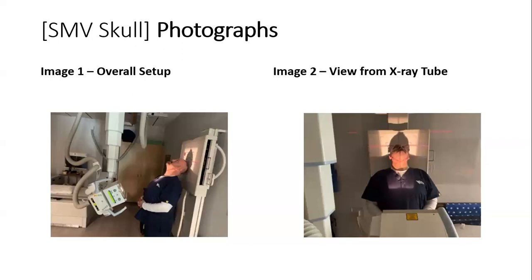Part position: raise the patient's chin and hyperextend the neck if possible until the IOML is parallel to the IR. If supine, rest the patient's head on the vertex, align the MSP perpendicular to the midline of the grid of the table IR. Avoid tilt or rotation.